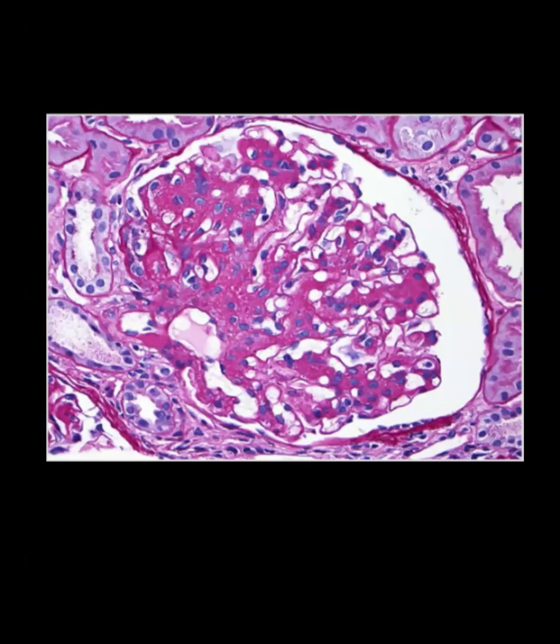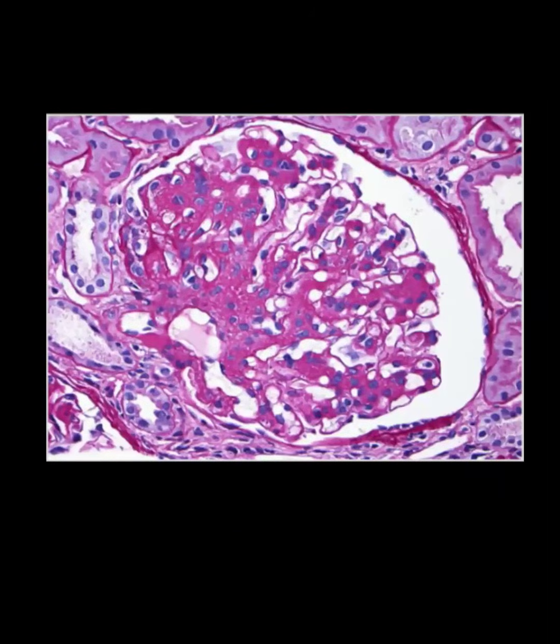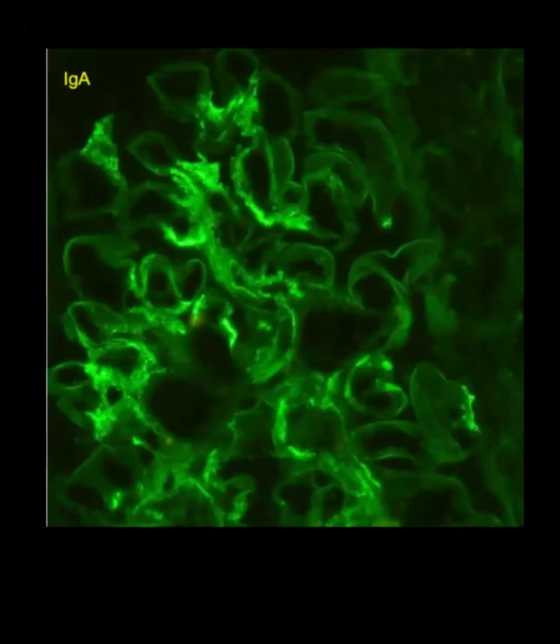Dr. Akil diagnosed the IgA nephropathy. Yes, it is mesangial deposits. You can see the capillary lumens are intact and open, but the space between the capillary lumens is increased. So it is an increase in mesangial matrix, and it is actually IgA nephropathy. Again, if they gave you both pictures, it is IgA nephropathy with mesangial deposits.